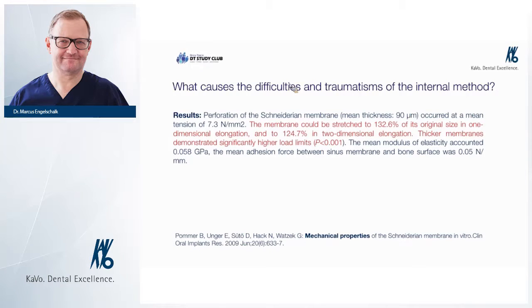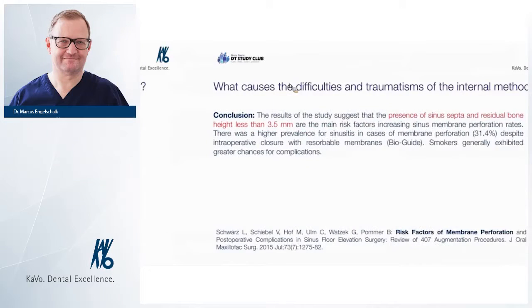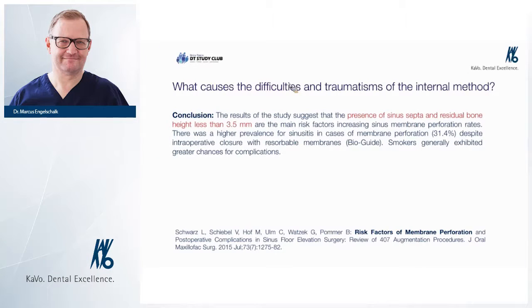You see the window. You see bringing in the implant, bringing in the augmentation material. It's more than one miracle at one time you have to perform for the patient. But it's still working. This is the same access, but we use the piezo to create the window to be able to not hurt the membrane. So if you have a look at the colored picture, you see it's the same like before. We just use the piezo instead of the burr or the drill.